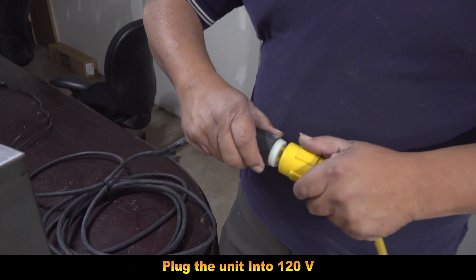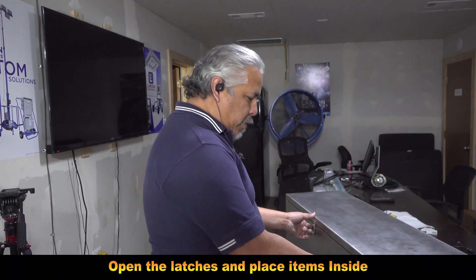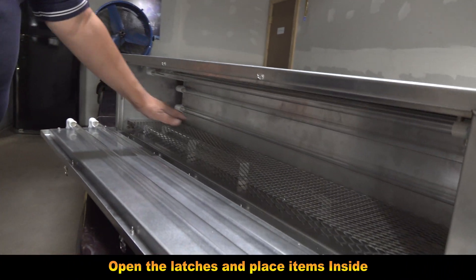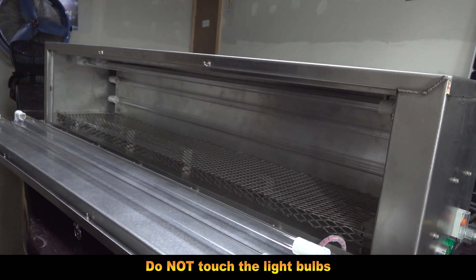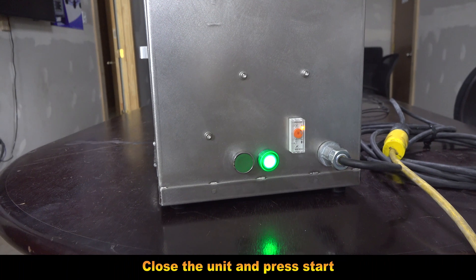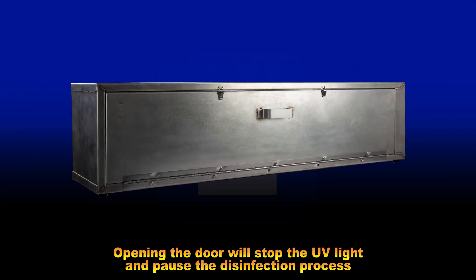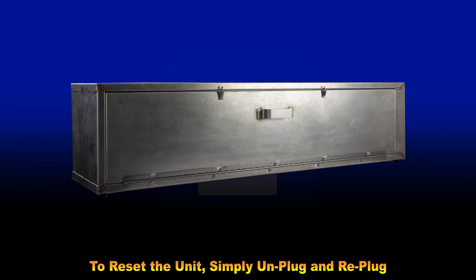How to operate: Plug the unit into 120 volts. The indicator light will blink. Open the latches and place the items inside the box. Never touch the bulbs. Close the unit and press start. The unit will disinfect for the set time. Opening the door will stop the UV light and pause the disinfection process. The disinfection process will continue once the door is closed. To reset the unit, simply unplug and re-plug it.